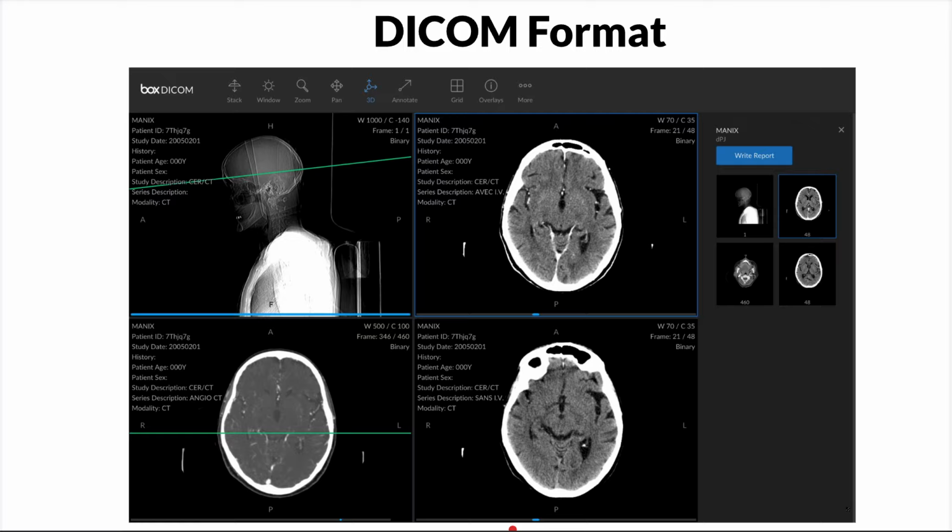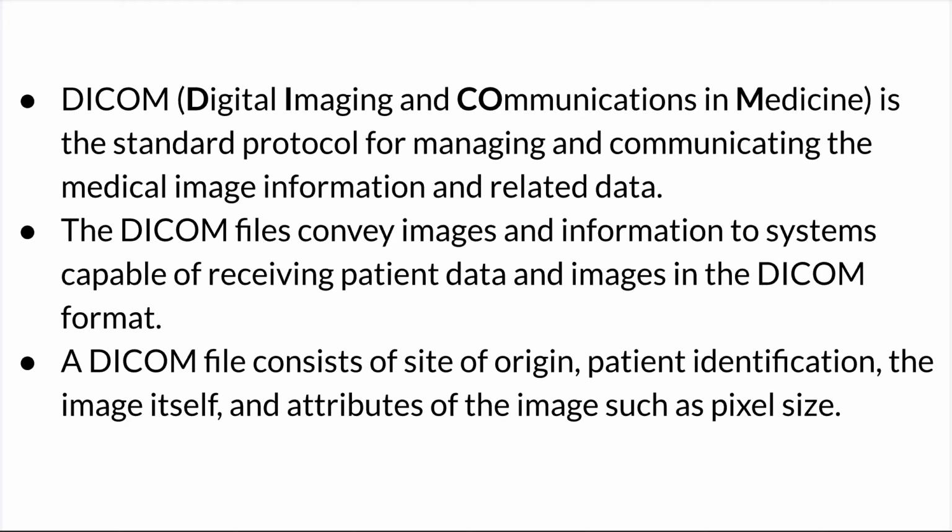I don't know whether TTH has some, but if you go for clinicals, you can ask if they have a DICOM system over there. The definition here, and somebody provided the full acronym: Digital Imaging and Communication in Medicine.